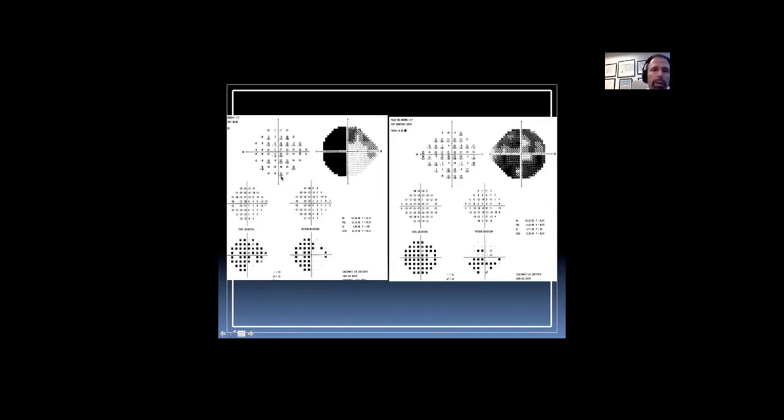The closer in, so if I see 3 points here with at least a 7 decibel difference. So for instance, up here, 3 and 17, well, that's a 14 difference. 3 and 8, well, that's not as interesting. 6 and 16, 10 points. 2 and 27, 25 points. So the closer you get to center, the more sensitive it is as well. So if I see a couple points centrally across the midline, that's a step. If I see 3 from the outside in, that's a step with at least 7 dB difference. That's going to be interesting to me.